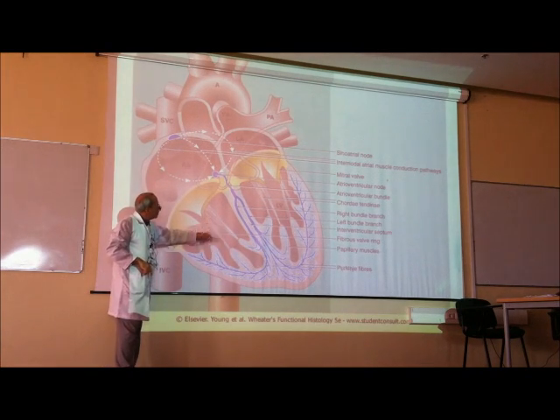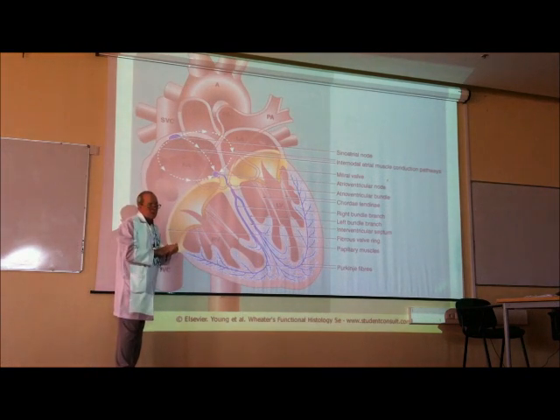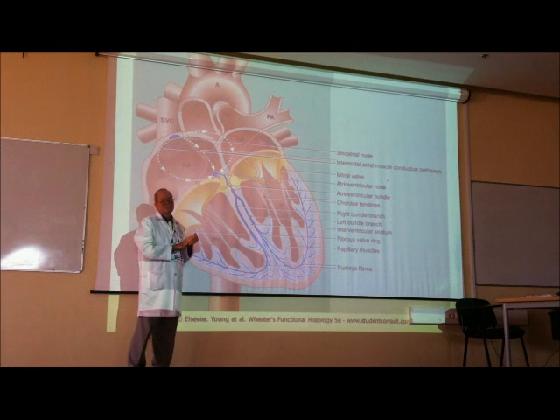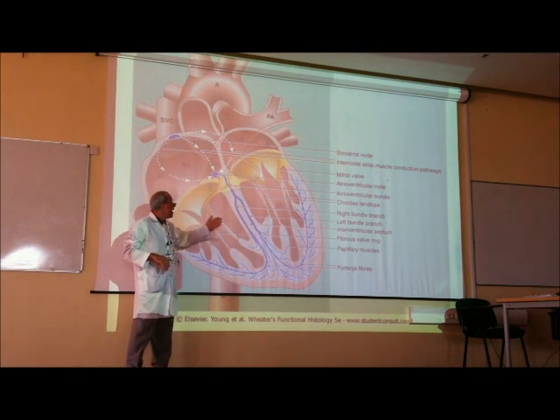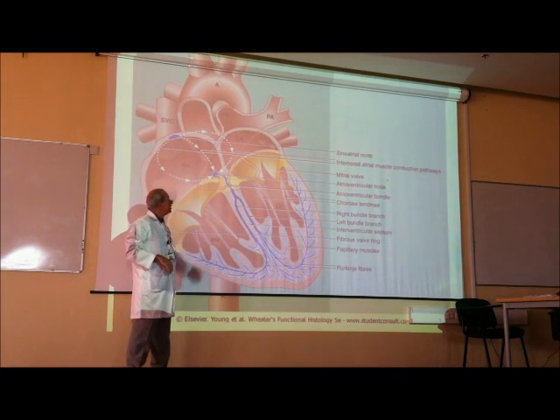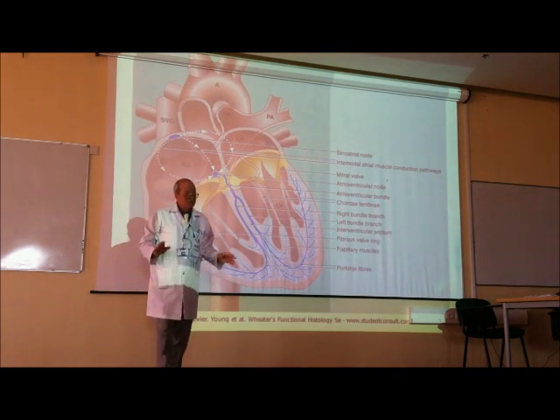So the papillary muscles are connected to valve leaflets by chordae tendineae. I finished now.